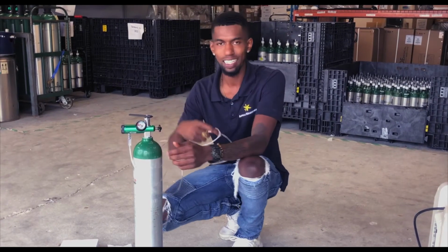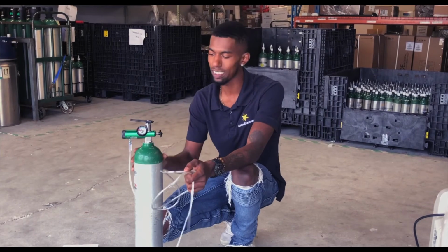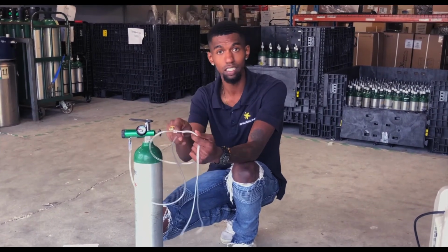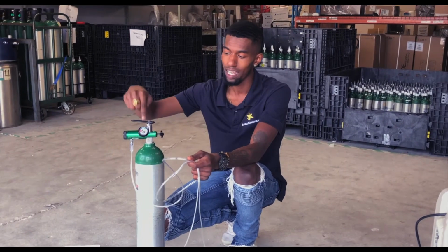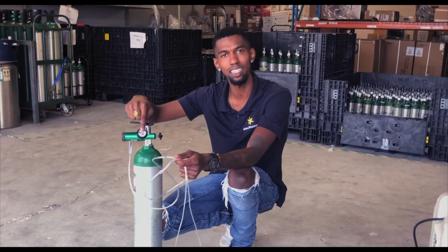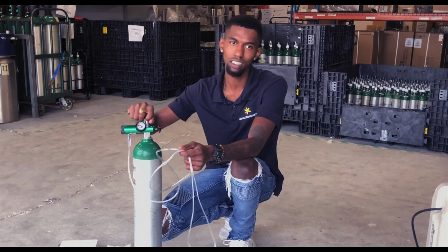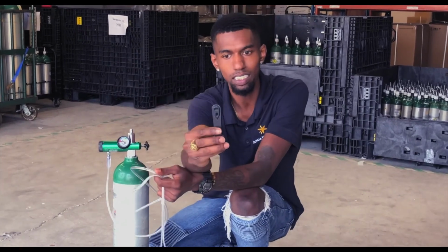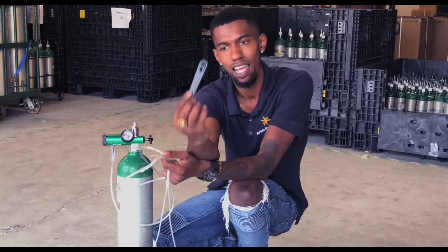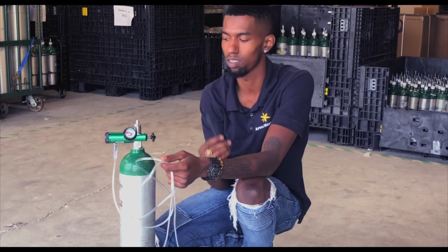Alright guys, today I showed you how to connect your regulator to your E-tank, how to connect your cannula to your regulator, how to find your liter flow, how to tell if the tank is actually full or if it has oxygen in it, and how to connect your key. And I showed you that your key should, nine times out of ten, have an arrow indicating which way you turn it to turn it on.